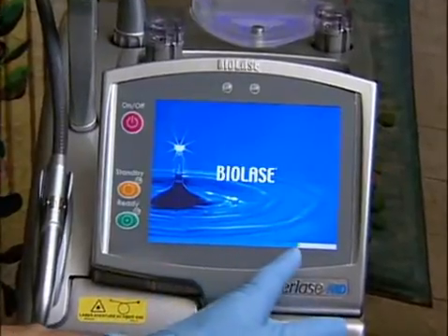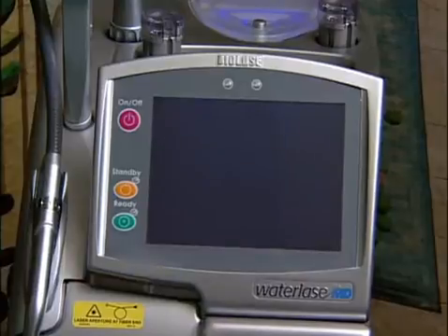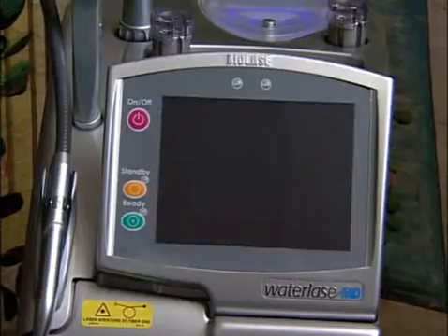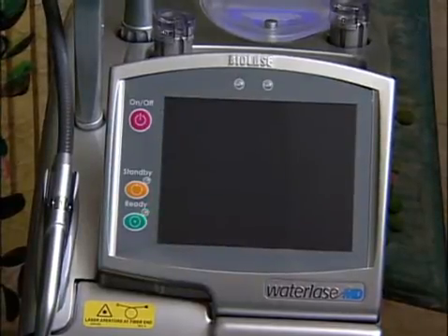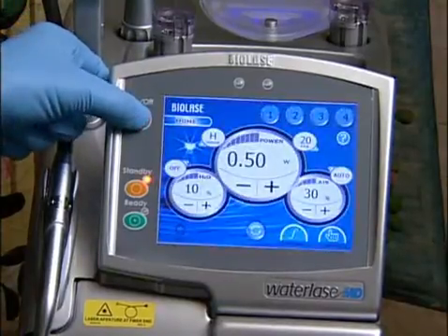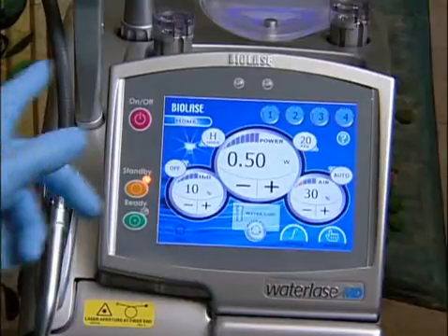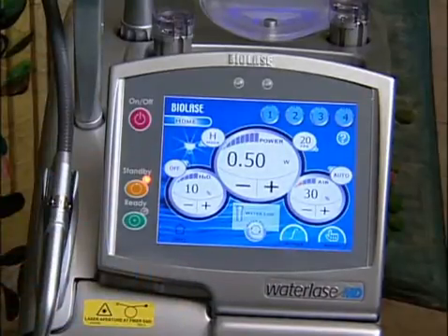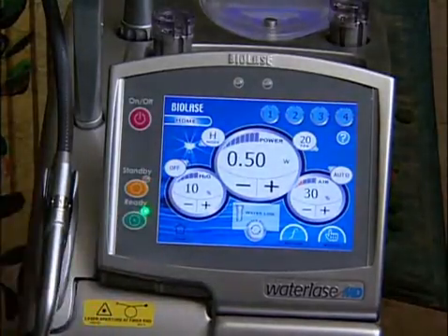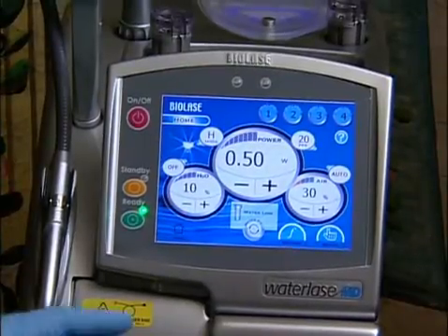See the image going across. Another beep that'll come. And now it's ready to go. So we press the on-off button, and that brings the screen up. And then we hit the ready button. Many nice features with this laser.